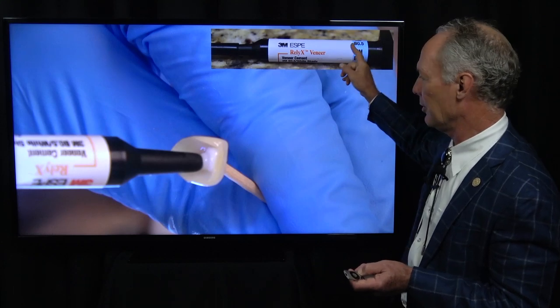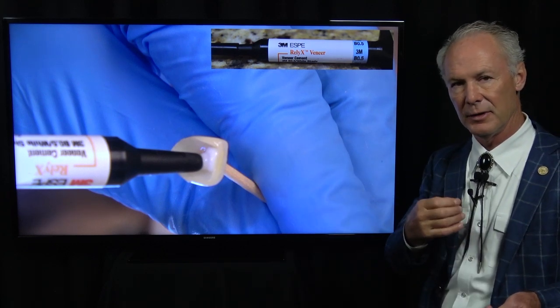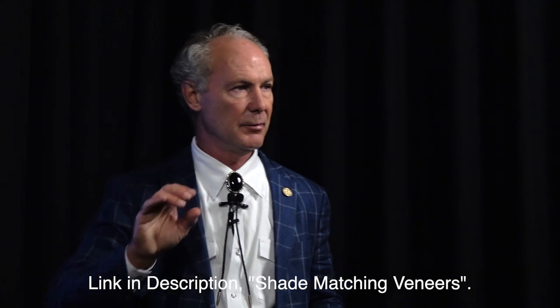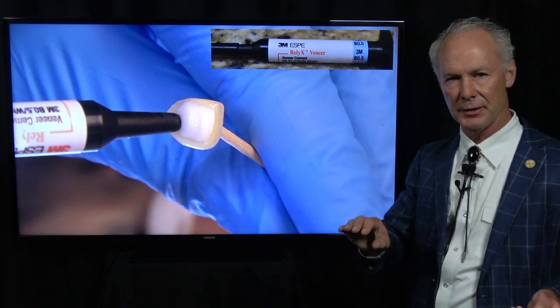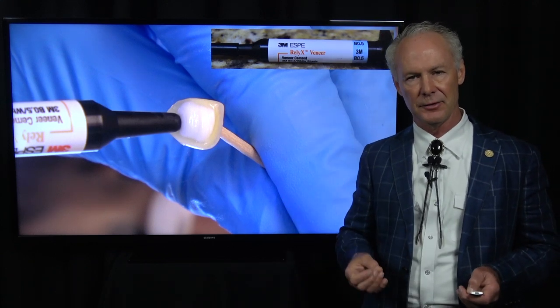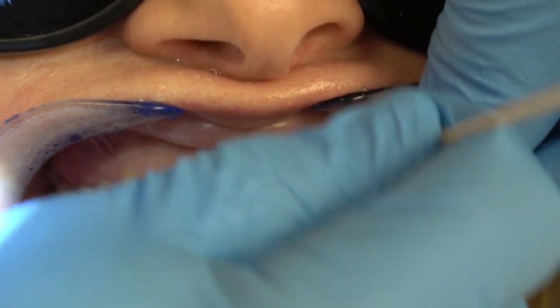In this case I'm using B0.5 because I wanted to make it just a tiny bit lighter. They were plenty good as-is, but a little lighter wouldn't hurt. I'm using a slightly lighter luting composite that won't have a big influence on the final shade but will move it just a little to the lighter side. You can refer to that YouTube video on shade matching difficult cases for how you decide which luting composite to use. I never use try-in paste — it's too messy, and you don't get the real shade of the luting composite until you cure it.